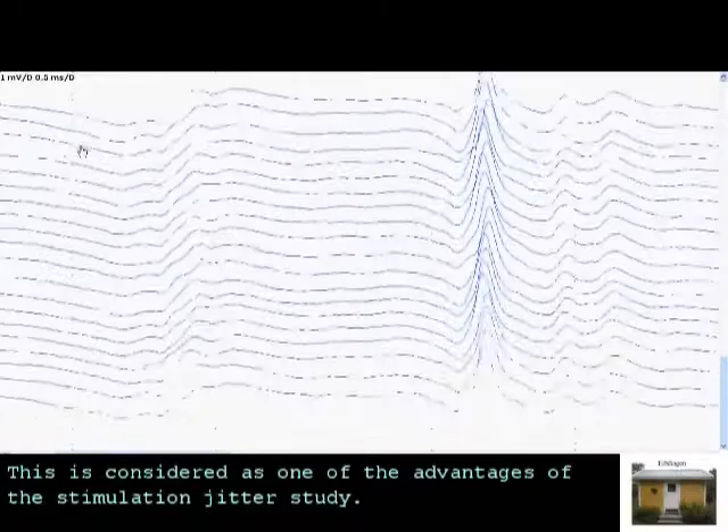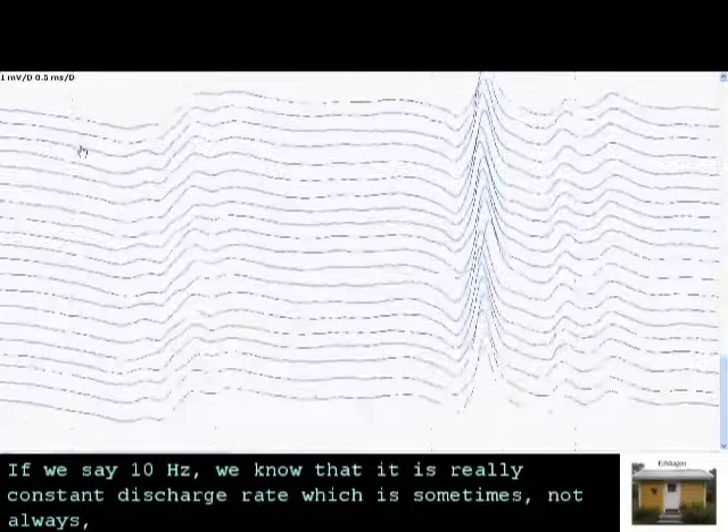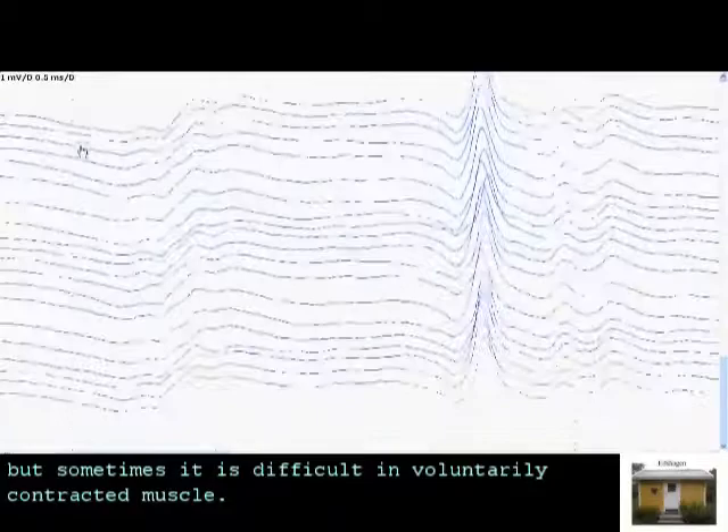This is considered one of the advantages of stimulation in the jitter study — we have perfect control over the stimulation rate. And if we say 10 Hz, we know that it is really a constant discharge rate, which is sometimes not obvious and sometimes difficult in a voluntarily contracted muscle.